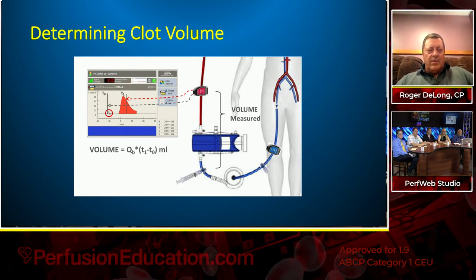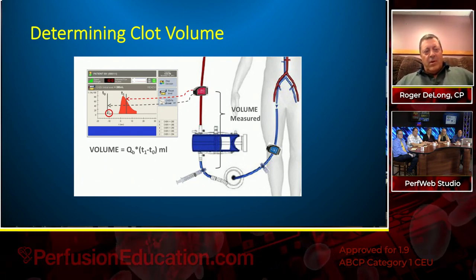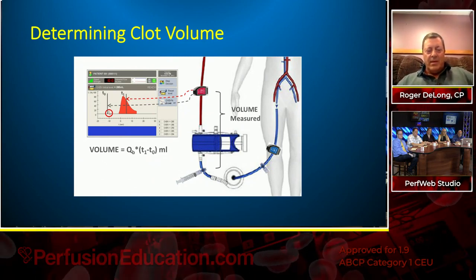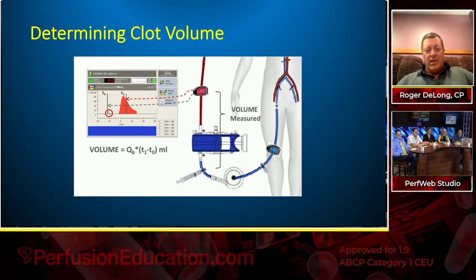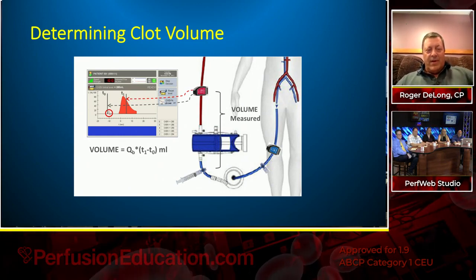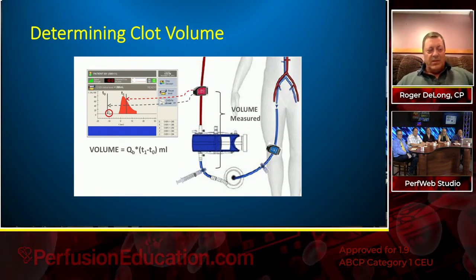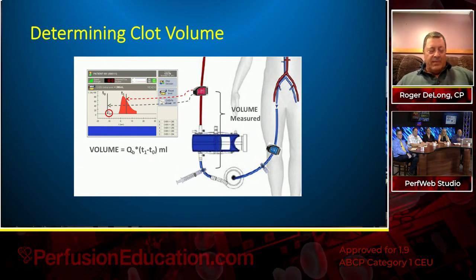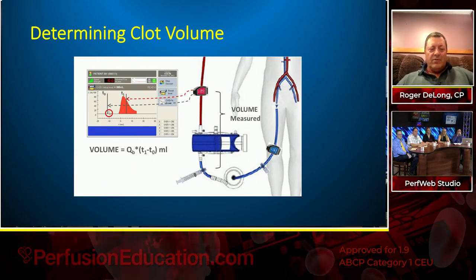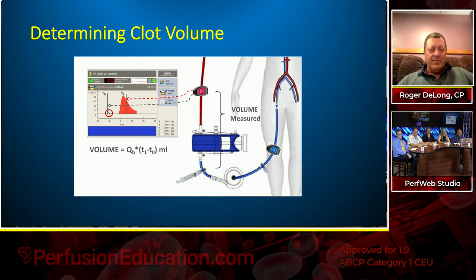Of interest here, also, since there's a venous sensor, it can also track, if you're on VV ECMO, say you've got the saline bolus moves into the patient, whatever percent of that bolus comes immediately out of the patient would also be recorded, and you can figure out the recirculation from that immediately and accurately. Any of you who have had intensivists scratching their heads desperately trying to decide if they've got to return a patient to an OR or let them be or move the cannulas again can realize this is a very frustrating situation. Same device, just 2 different uses of it. Next picture.